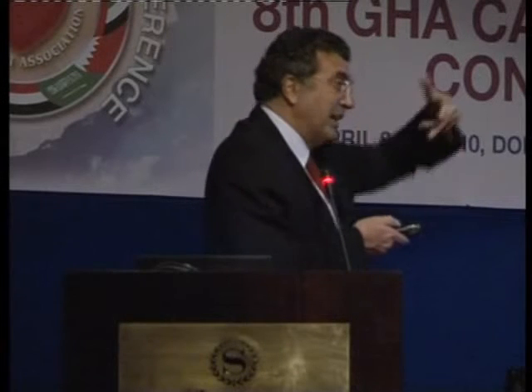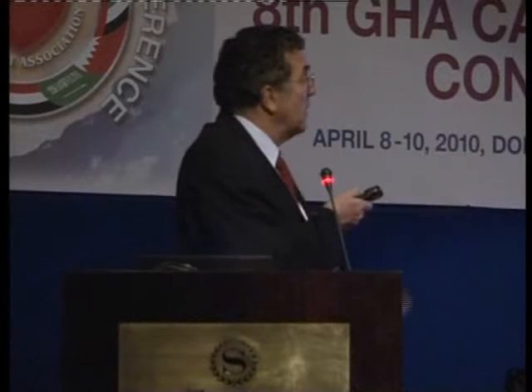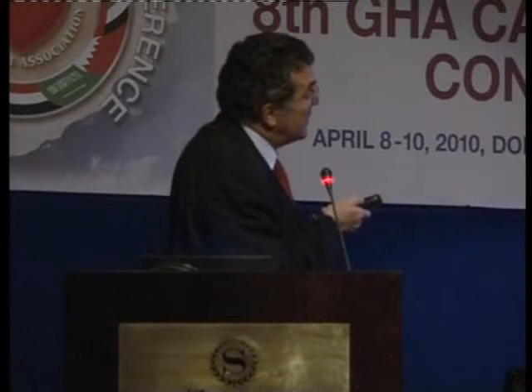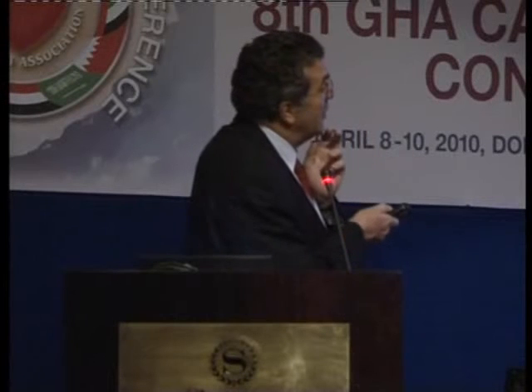And if effectively, in different views, it could be AP cranial or LAO cranial, we think that there is some carina shift from here to the diagonal, we have to finish with the kissing. But if we place a balloon, it should automatically be a second stent, because with a long balloon like that in this vessel of 2.5 millimeters, we know the result, unfortunately.